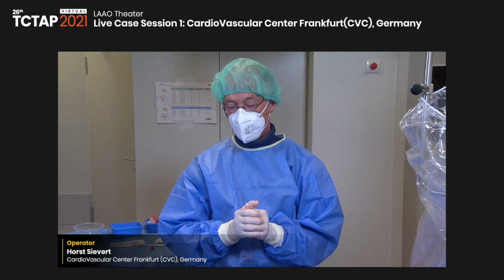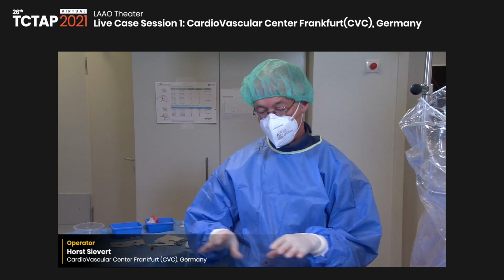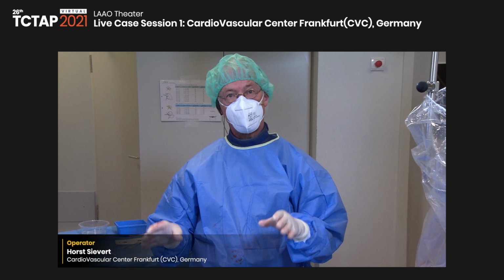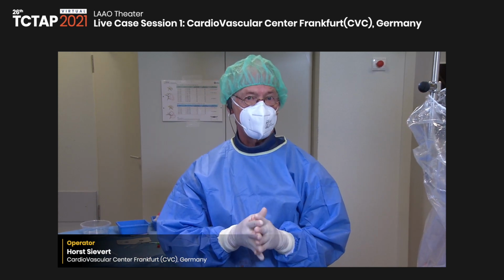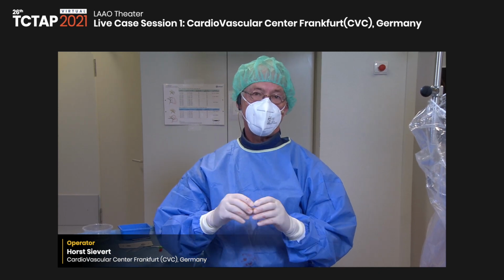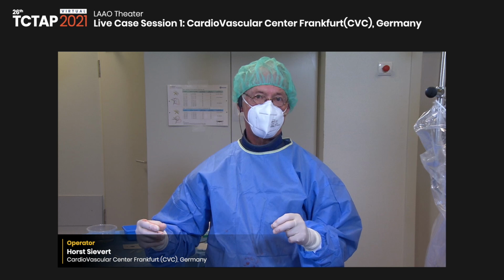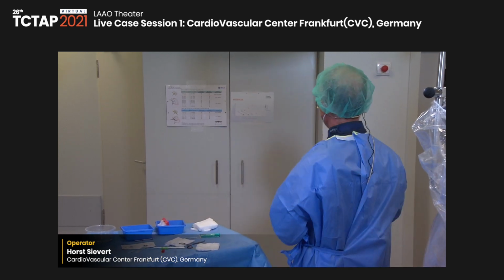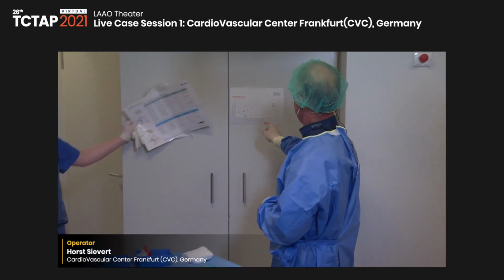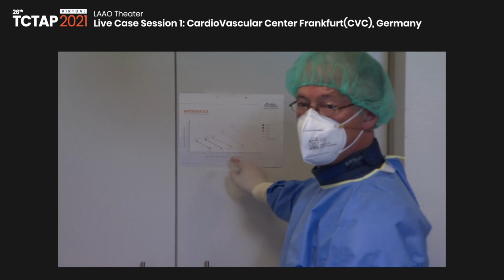And so there's a wide overlay between the different sizes. And you could use the 35 for even the smallest appendage. The only disadvantage then is that it becomes longer and longer. So you need a long appendage in order to use the 35. But when we can look here at the sizing chart from the Watchman Flex, for example, the 35. So this is the, can you see this on the screen?